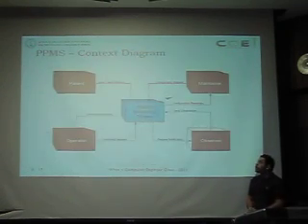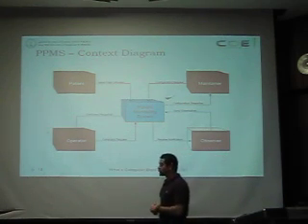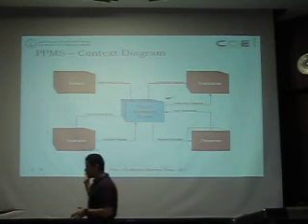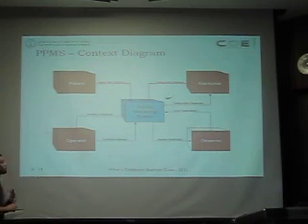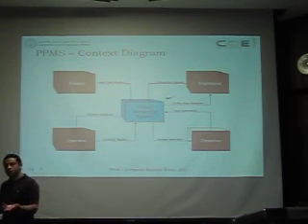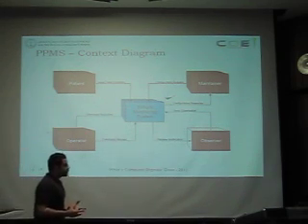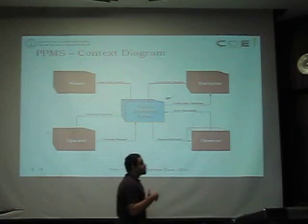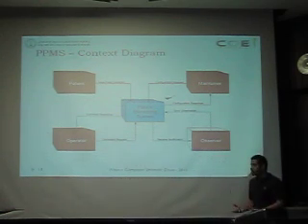The context diagram of the portable patient monitoring system is this, and we have 4 kinds of users for the project. We have the patient, who can issue a panic button whenever an emergency situation occurs. We have the operator, which is the user that is located in the control room to monitor the patient's status.